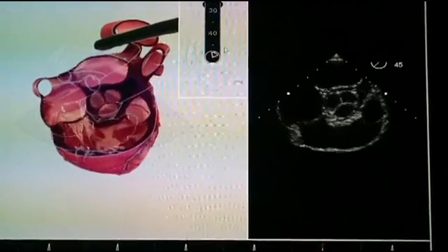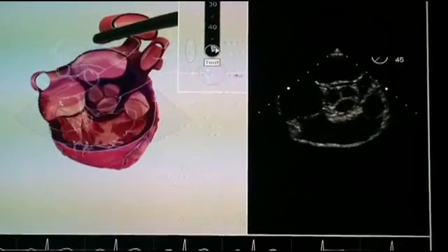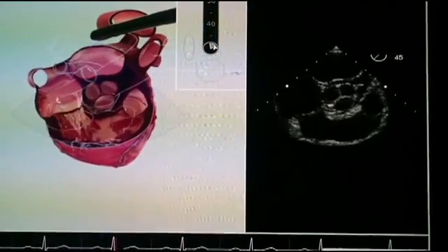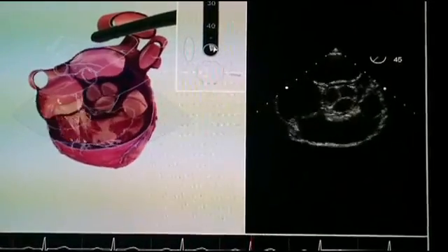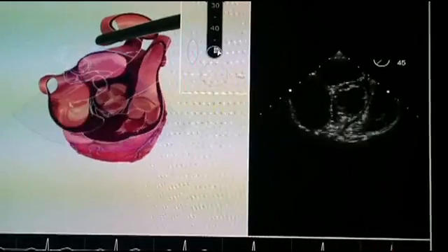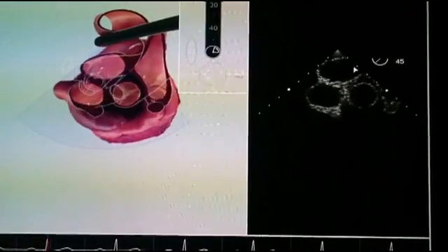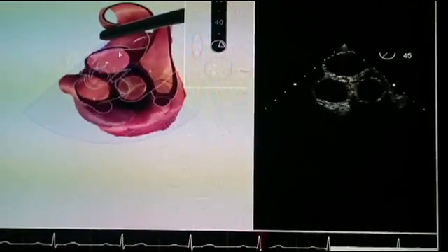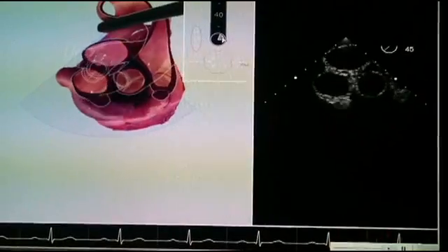So what I need to do here is to rotate to the right of the patient, or clockwise rotation. I'm rotating like that. Still here I'm cutting the left atrium — I can also see the left atrium in the simulator image. More rotation. Now I'm cutting both right pulmonary veins at the same time. Here's the right upper pulmonary vein and here's the right lower pulmonary vein — again, an inverted V-shaped pattern.